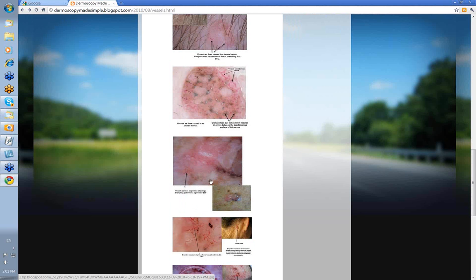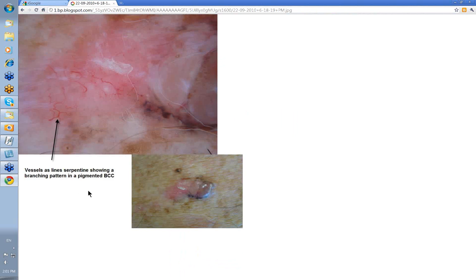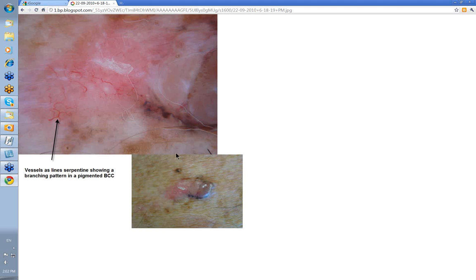This is the clinical down here. You might have thought that was melanocytic, perhaps a hypomelanotic melanoma. But you've got vessels here — a serpentine with a branching pattern. And this is a feature that you'll see in a pigmented basal cell skin cancer.